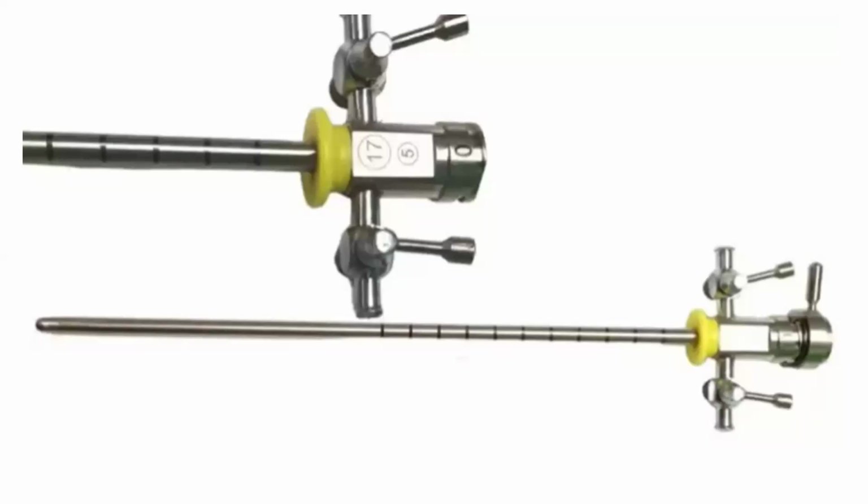And which is the smallest one? 17? Or is anything smaller than that available or not available? Pediatric scope is available, sir. And even mini perc sheath, sir. No, we are talking of the cystoscopy. Okay. Pediatrics. Yes. So now tell me, what are the uses of different sizes?